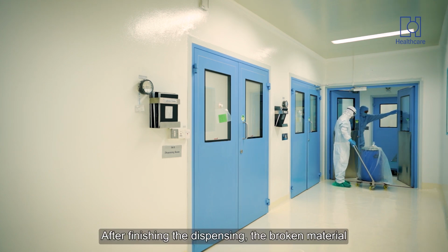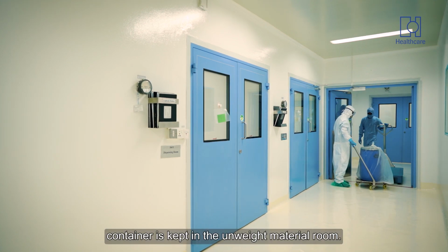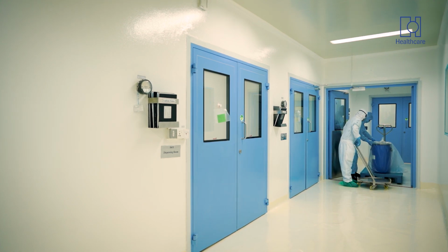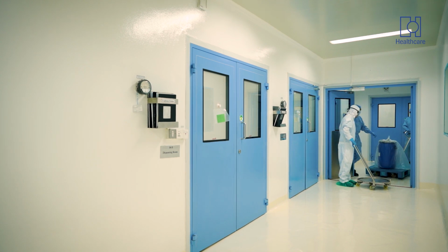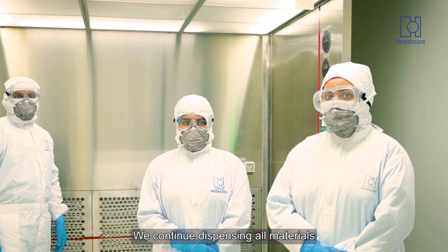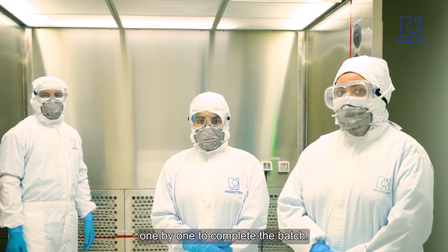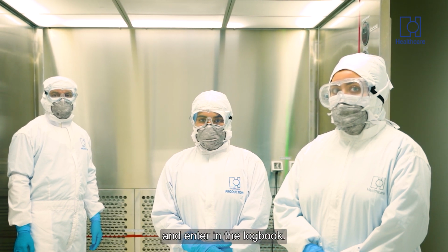After finishing the dispensing, the broken material container is kept in the unweighed material room. We continue dispensing all materials one by one to complete the batch. Then keep the dispensed material in the WIP room and enter it in the logbook.